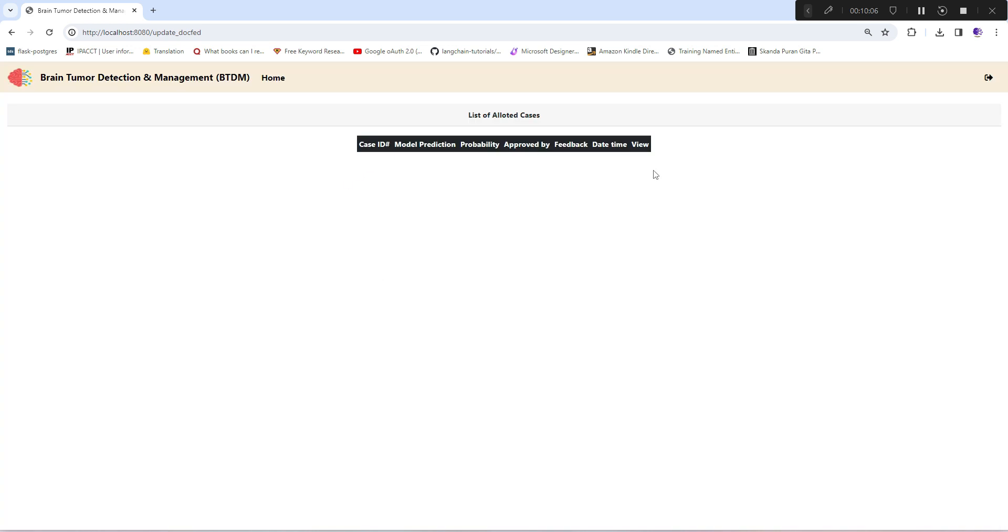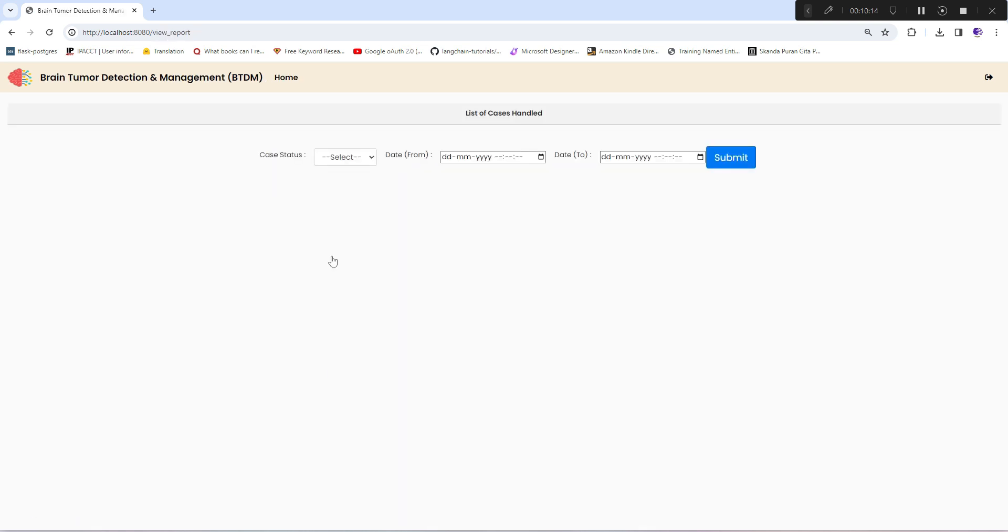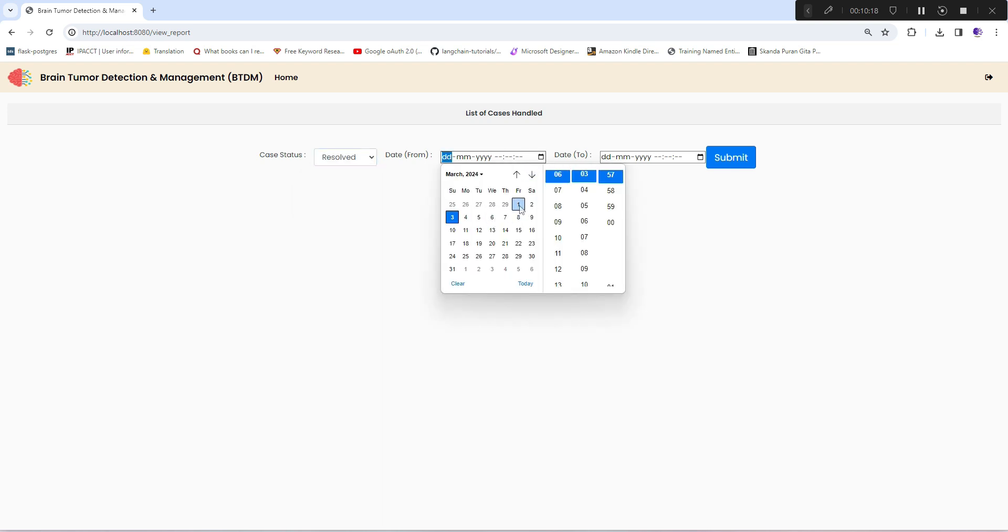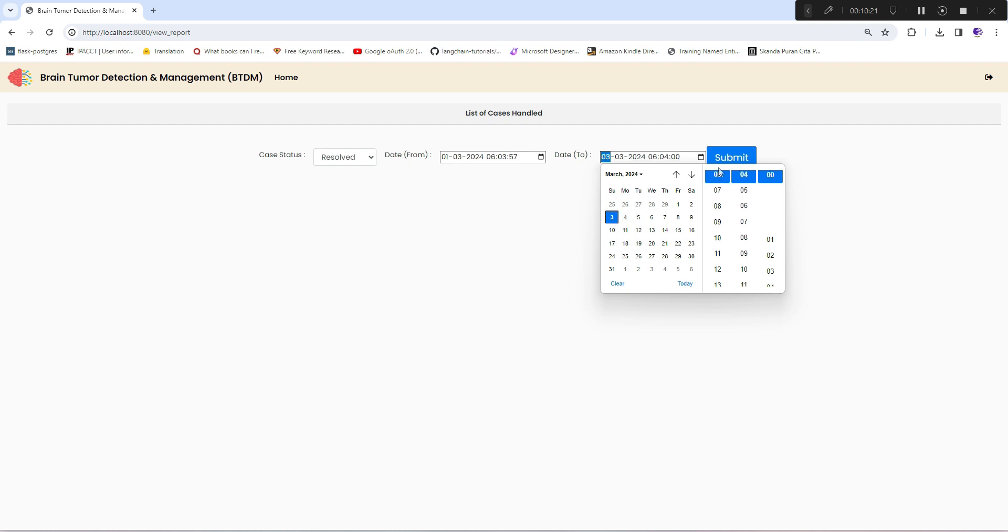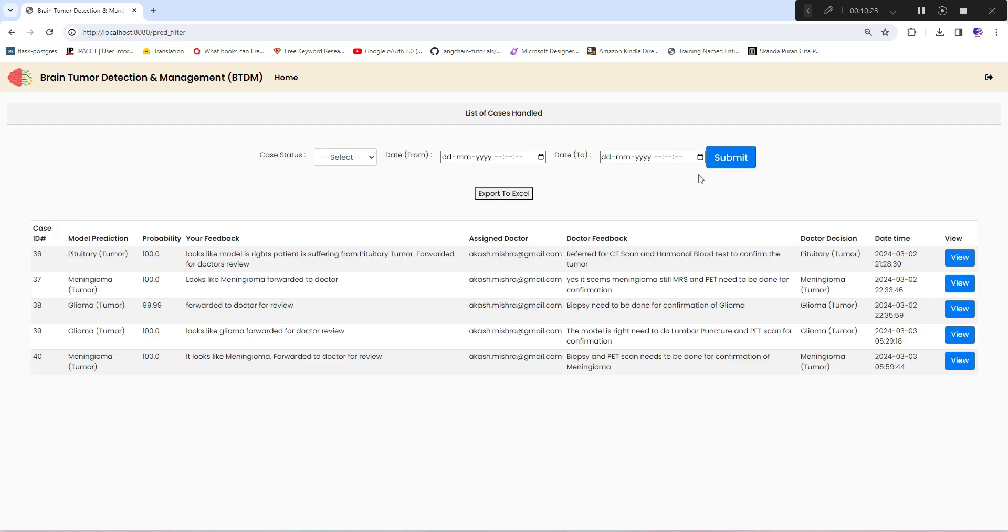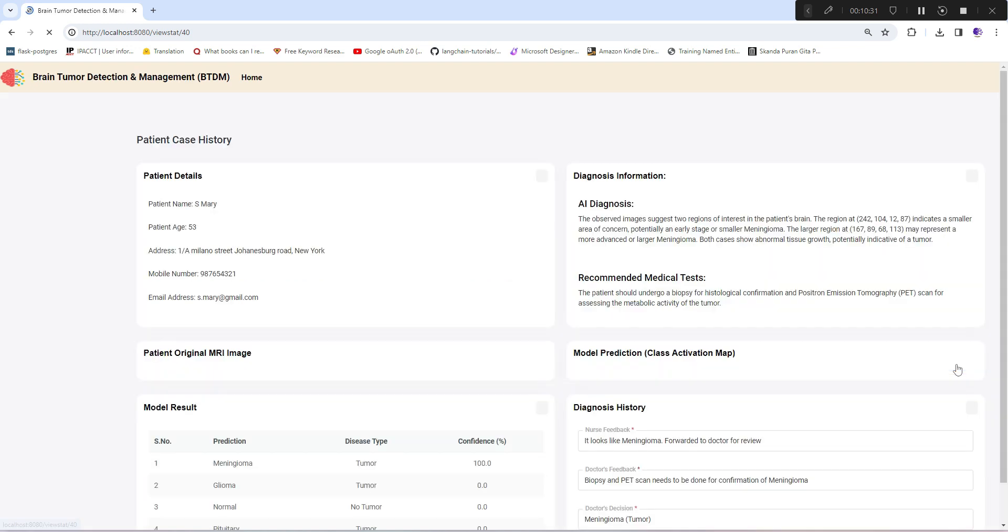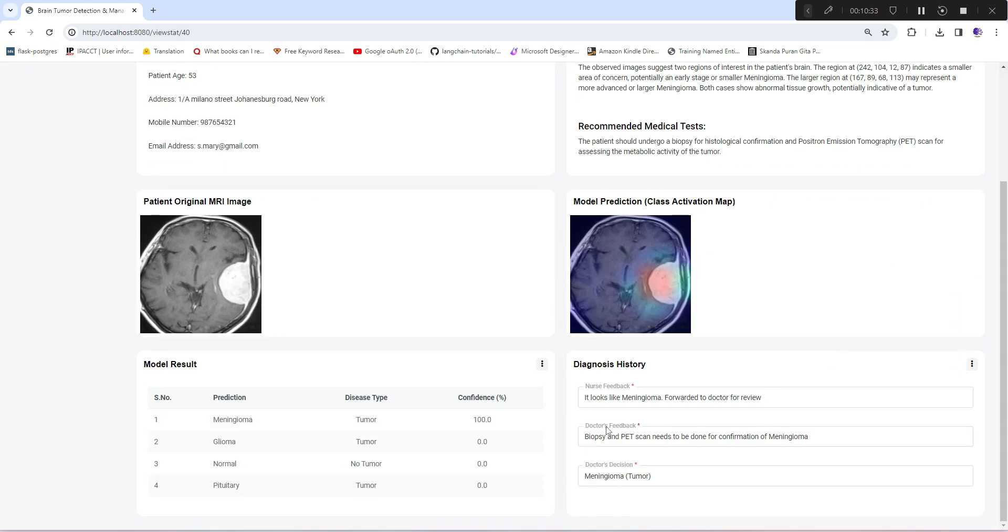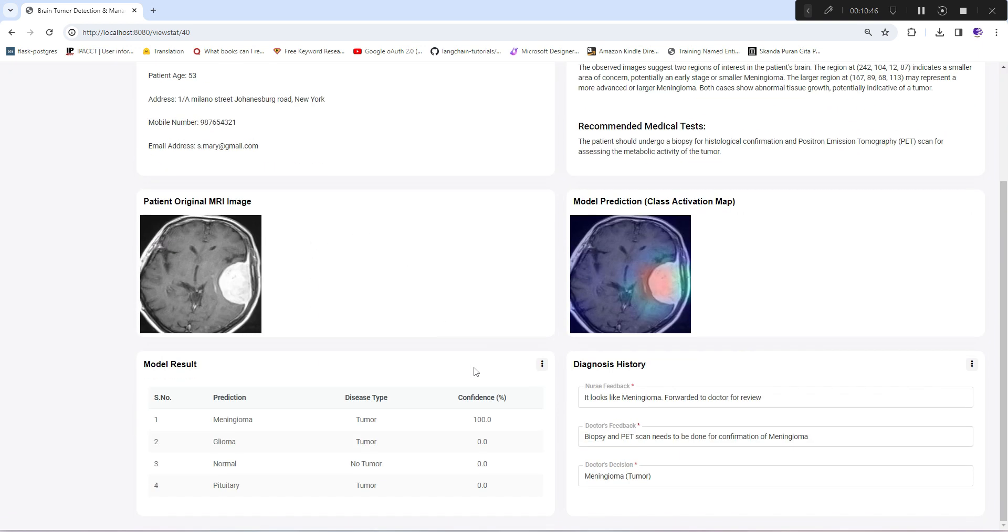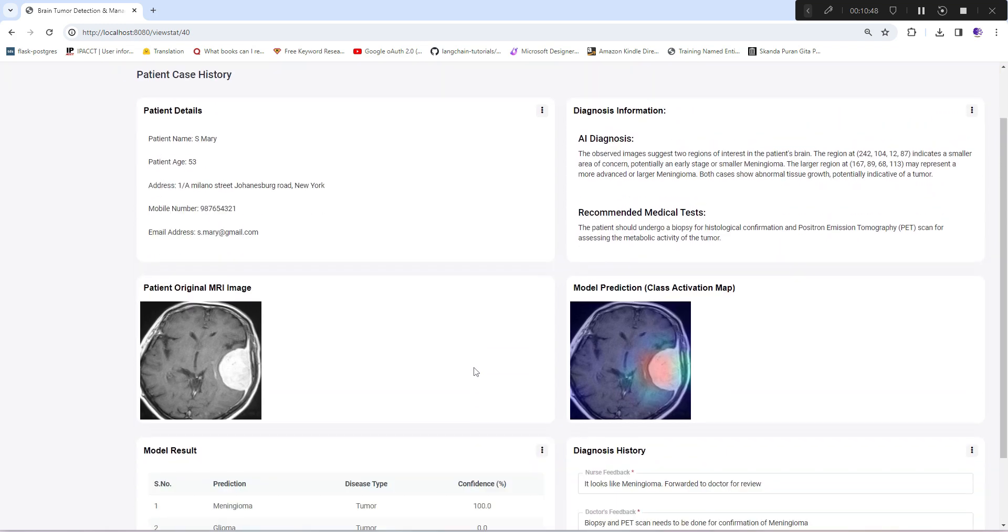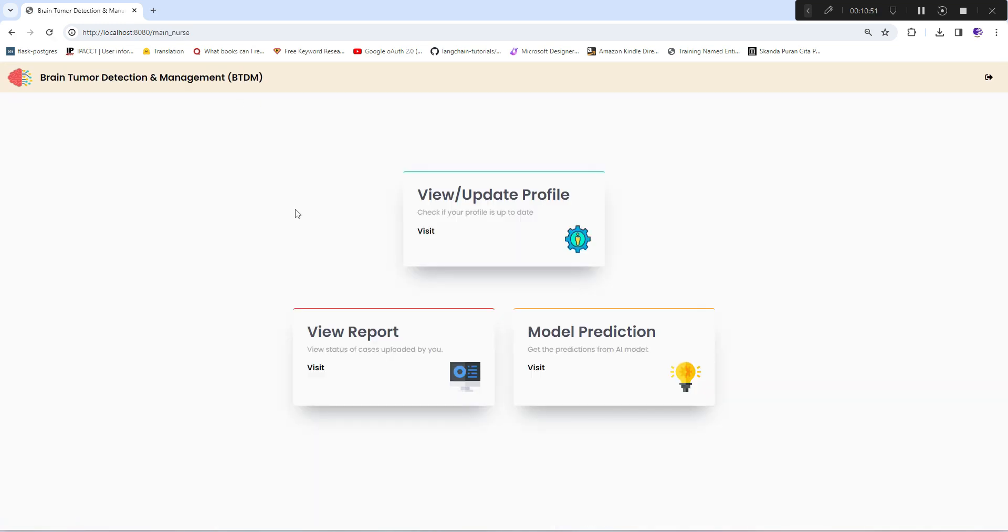It is closed and no available allotted cases are visible now. He can also visit view report and check all the resolved cases by him. You can see all the cases he has handled, and this is the last one he recently handled. He can also view it where his doctor's feedback and decision is fixed - he cannot change it, there's no submit button, it's just a view of the case he has handled with all the details.